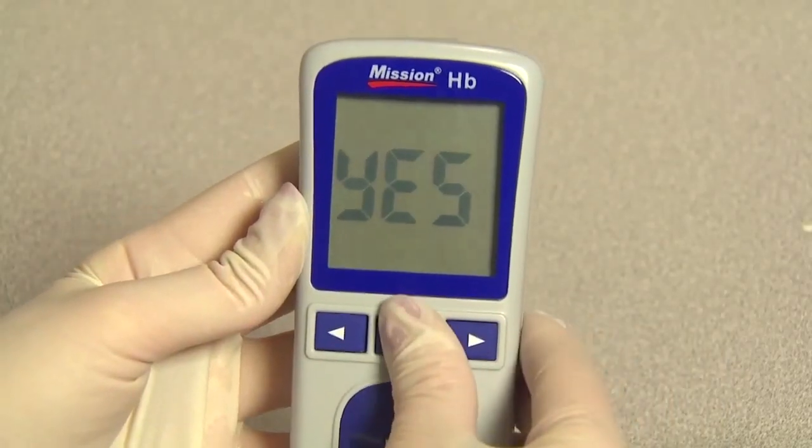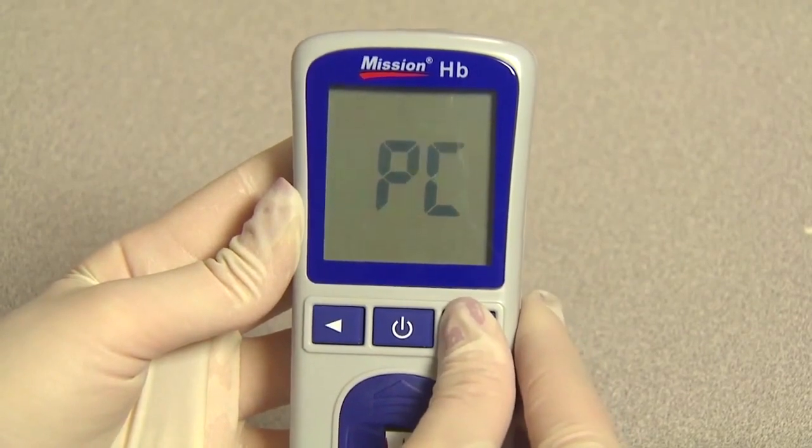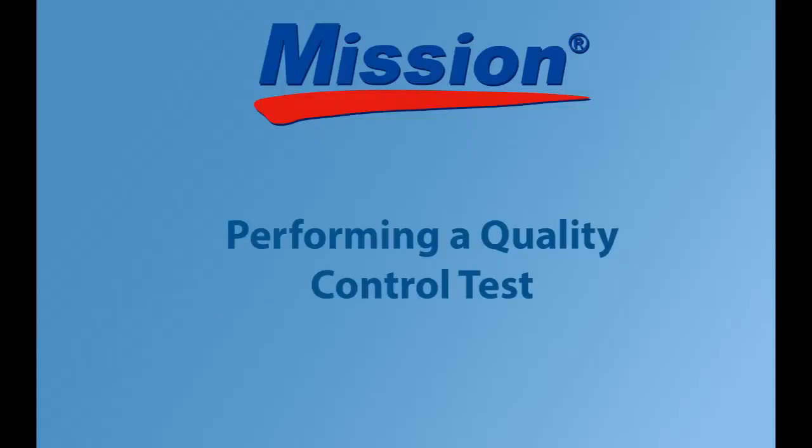Press the power button to return to the setup screen, or navigate to the ELT screen and press the power button to return to the testing screen.